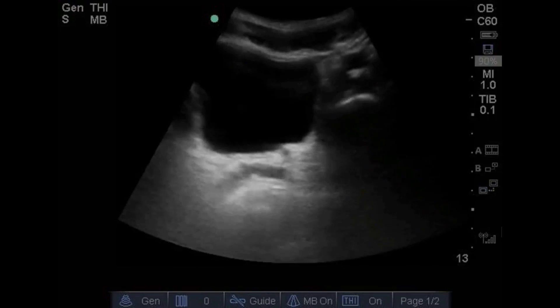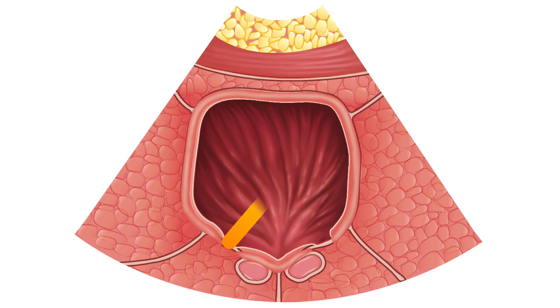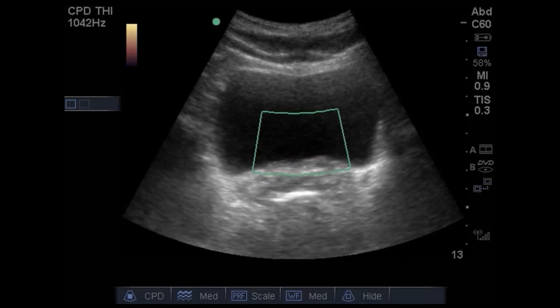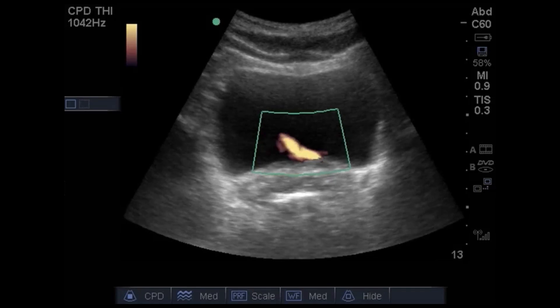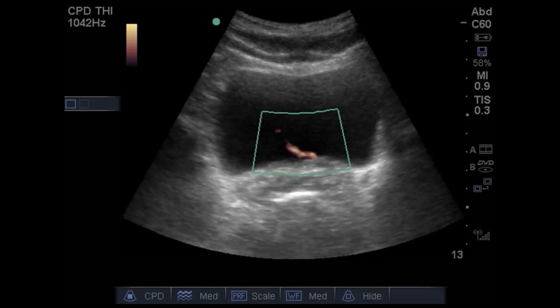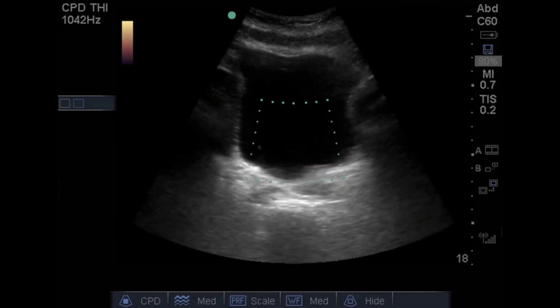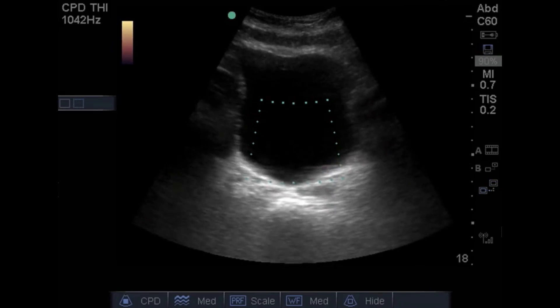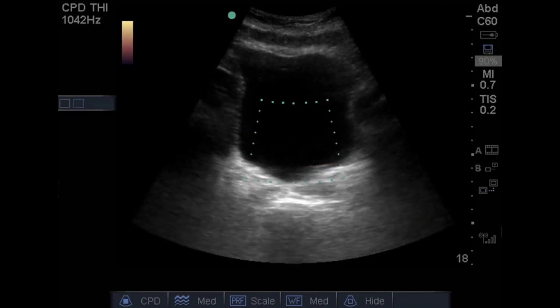Sometimes the ureter is more prominent and there may be hydroureter all the way to the distal bladder implantation. Ureteral jets are directed from one ureteral orifice across the bladder to the contralateral side at an angle. To evaluate for ureteral jets, use power Doppler to image this low-flow state jet of urine entering from the ureter into the bladder. Make sure the bladder is set to anechoic so you can easily pick up the jet at the level of the trigone and ureteral orifice. Power Doppler picks up lower flow states and is more sensitive, which is why it's preferred over color Doppler.